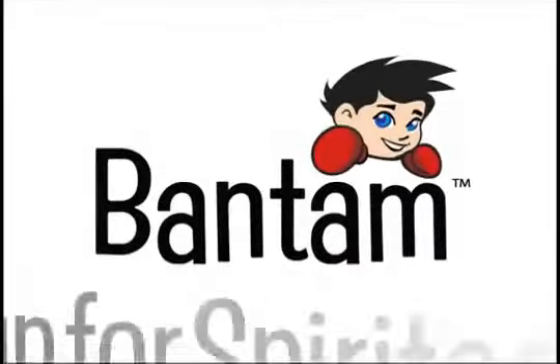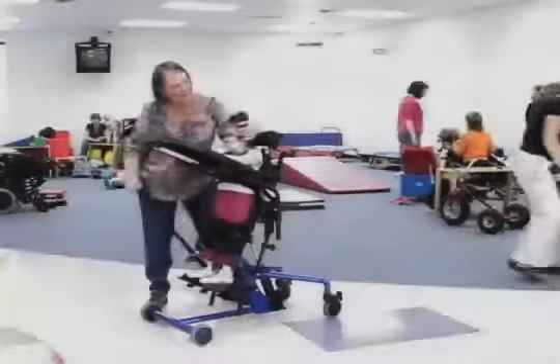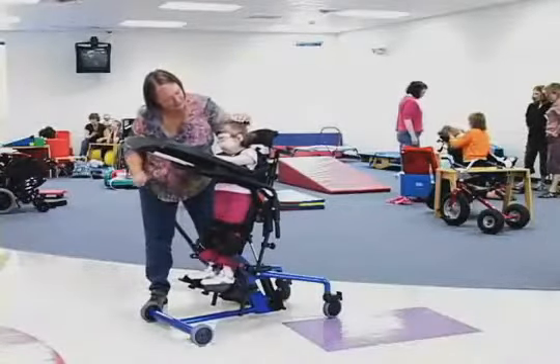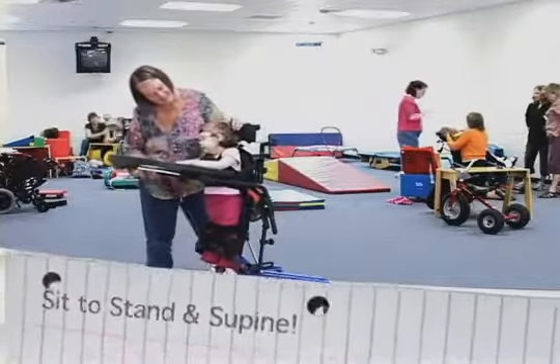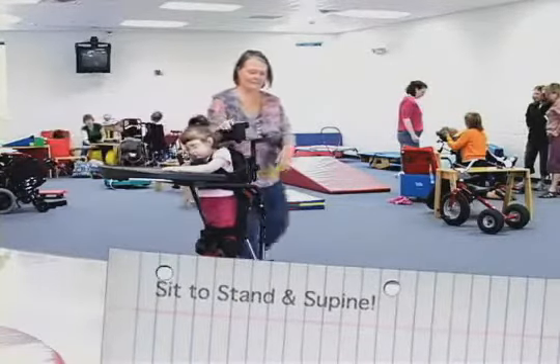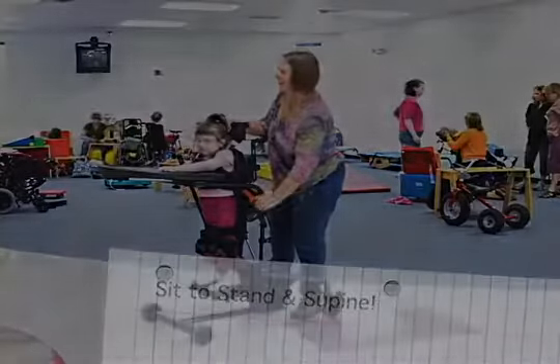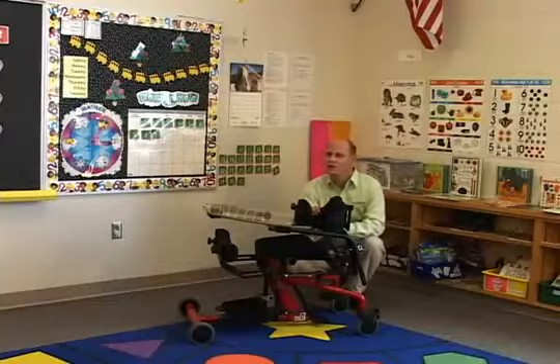Easy Stand Bantam — standing up for spirited kids. The Easy Stand Bantam is a standing system designed for kids who use wheelchairs. It is the only pediatric stander to combine the positioning of both a sit-to-stand stander and a supine stander in one easy-to-use piece of equipment. The Bantam accommodates for contractures in a way that no other stander can.